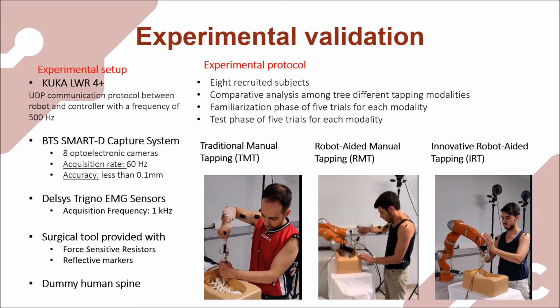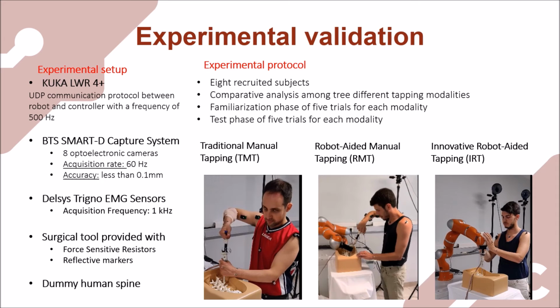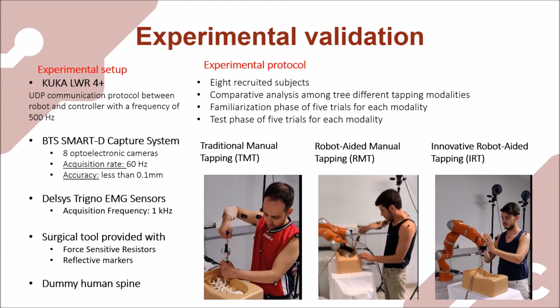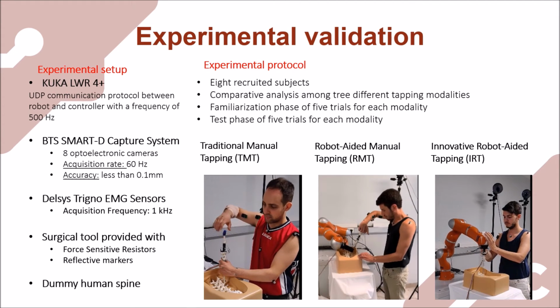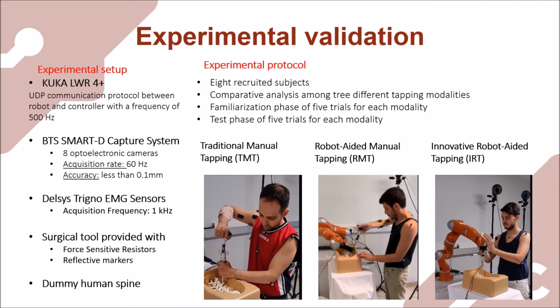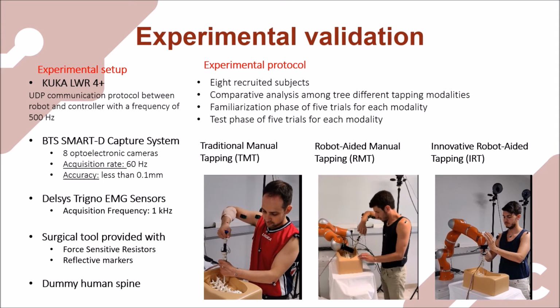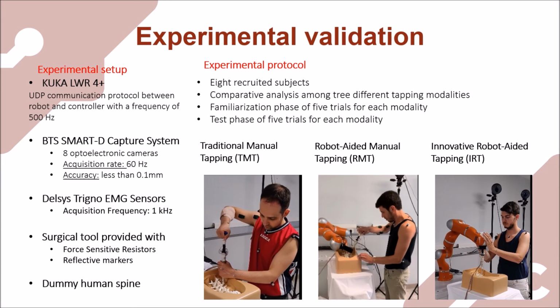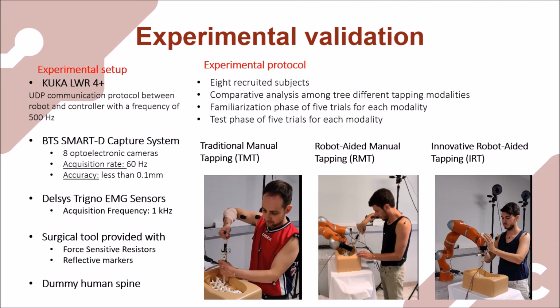A comparative analysis among the proposed approach and the ones typically adopted in literature to perform pedicle screw placement was carried out. 8 healthy subjects were involved in the experimentation. They were asked to tap the pedicle screw path in a dummy spine in 3 different modalities, as you can see in the slide: traditional manual tapping, traditional robot-aided tapping, and by means of the proposed approach.